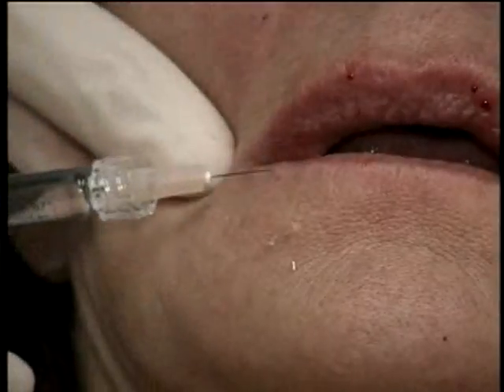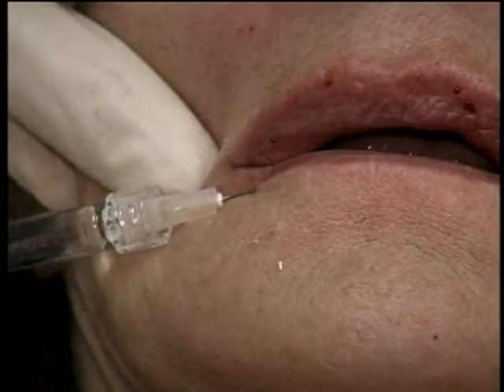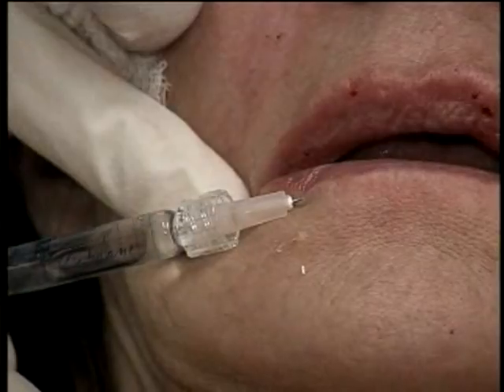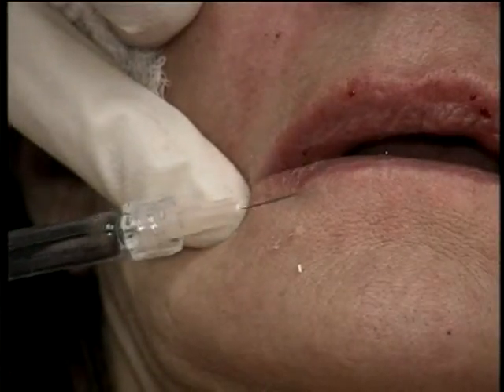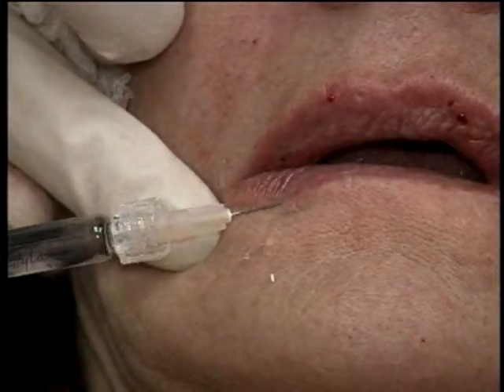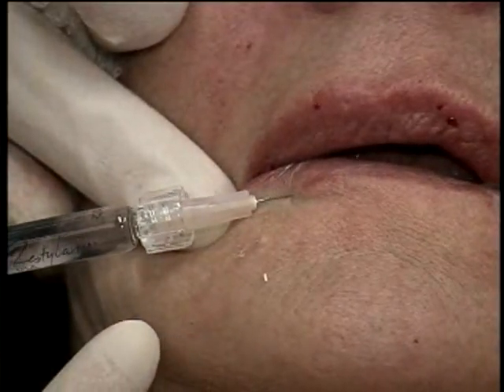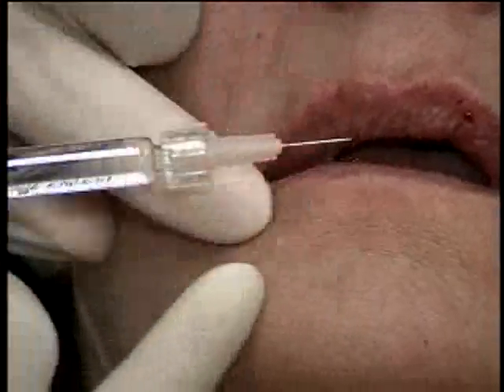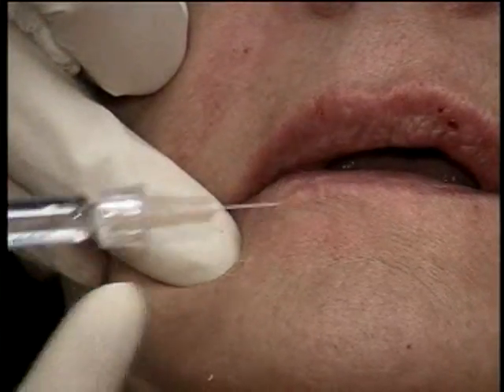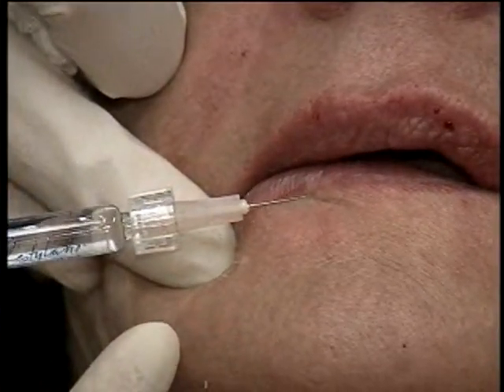Now this 30 gauge needle I think works very nicely here. So that's my preference. And I'm right at the red-white lip border junction. I'm staying at a consistent depth, consistent speed, and consistent in how much product I deposit.